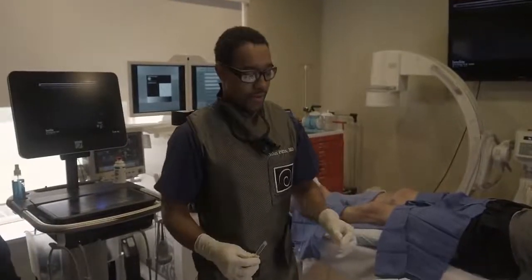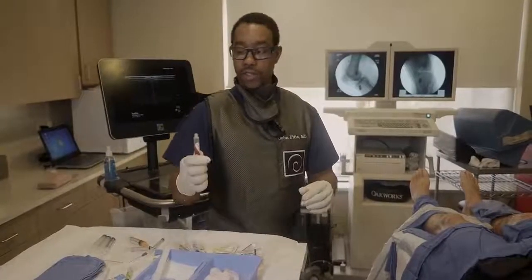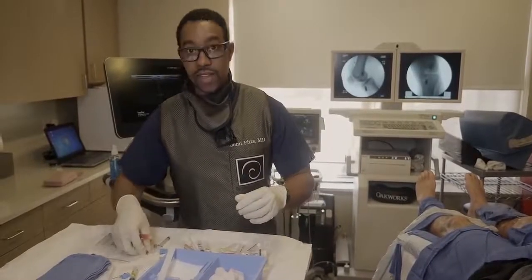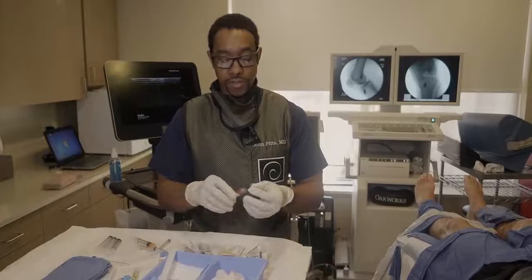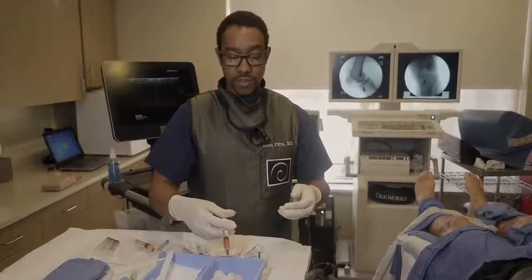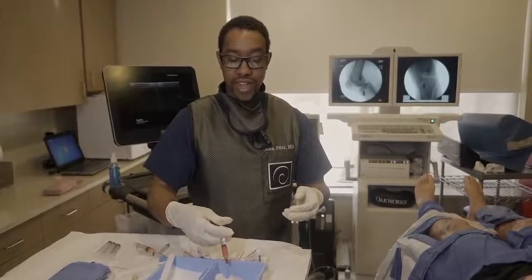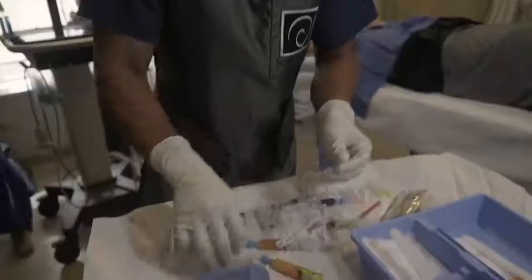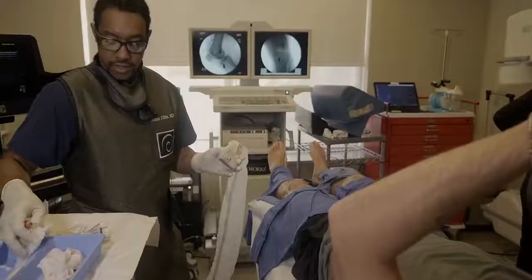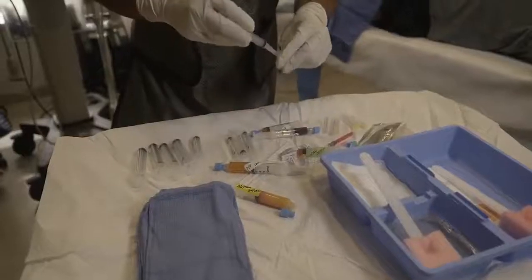Cole is a young athlete and has a meniscus tear. In addition to treating the meniscus, we also want to treat the MCL, which is the ligament that supports the meniscus. We also treated his patella tendons because it had defects from his prior surgery history of using the patella tendons for ACL reconstruction. And we're going to treat the hamstring tendon because he also used the hamstring for a second ACL reconstruction. We want to treat this whole knee as a functional unit — making sure we don't focus on just the meniscus but everything else that's contributing to the pain or dysfunction.